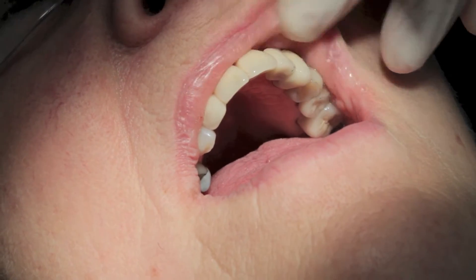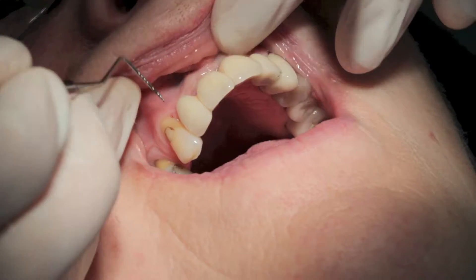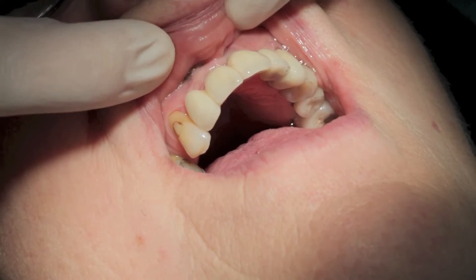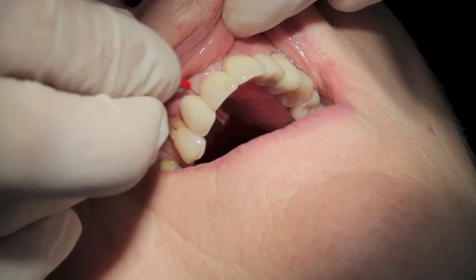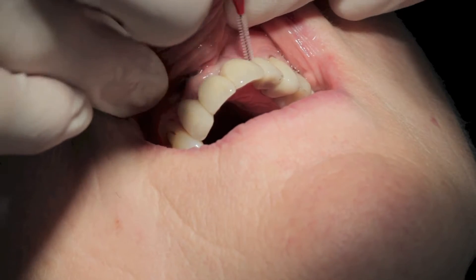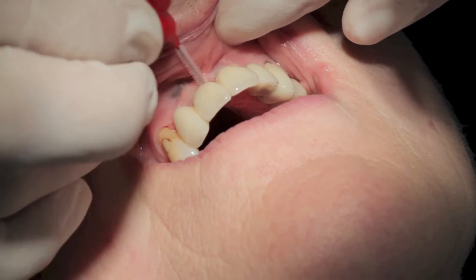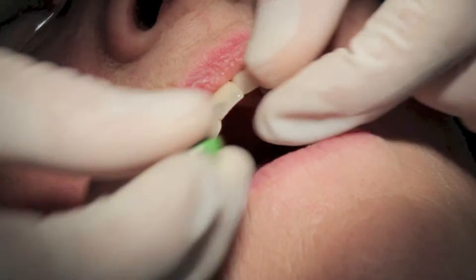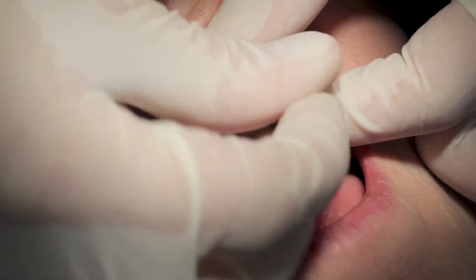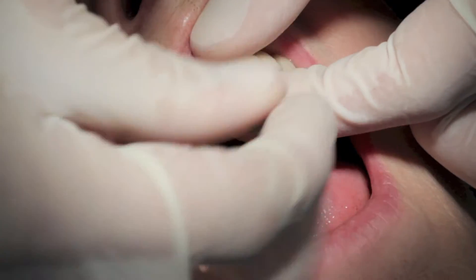It's very important to make sure that we're able to allow our patients to clean between and around these replacement teeth, so I'm just going to try a small red teepee brush to ensure that this is possible. Just a bit tight there by the looks of it. Is that sore when we're doing it? What I'm going to do is remove the bridge and just ease up the space here for the brush to pass to help with cleaning, because if it's not comfortable to clean then it won't be done.